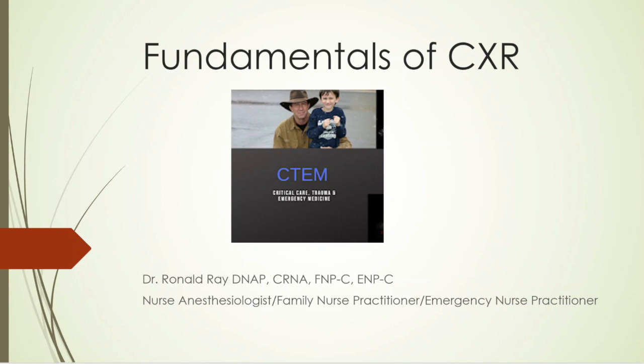Hey guys, I am doing a podcast on fundamentals of chest x-ray. I think this is really important. A lot of people don't have the basics down or don't follow the basics, and there's really a simple way of reading a chest x-ray.